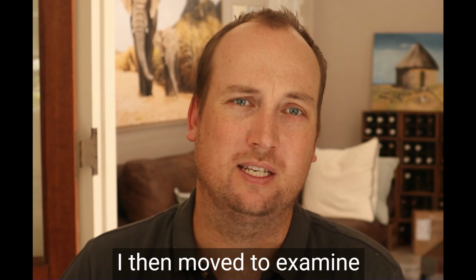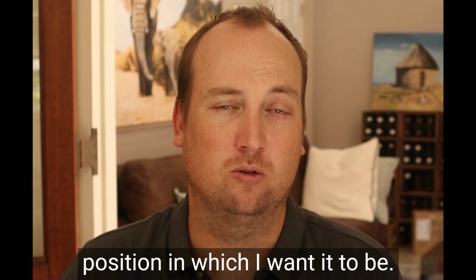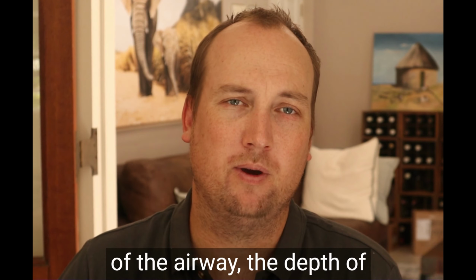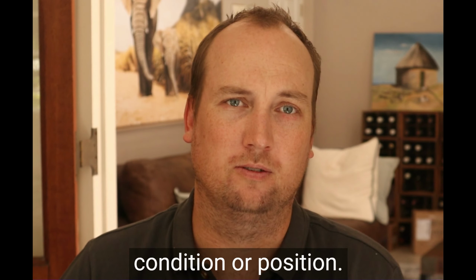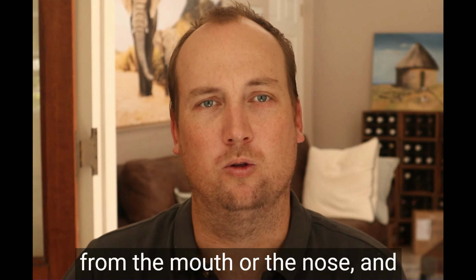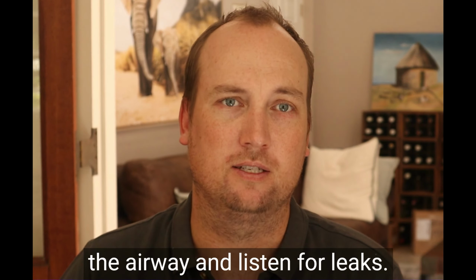I then move to examine the patient's airway. I look to see if the airway is still adequately secured and in the position in which I want it to be. This includes my strapping of the airway, the depth of the airway, and its general condition or position. I look for bubbles originating from the mouth or the nose, and I can also place my ear close to the airway and listen for leaks.